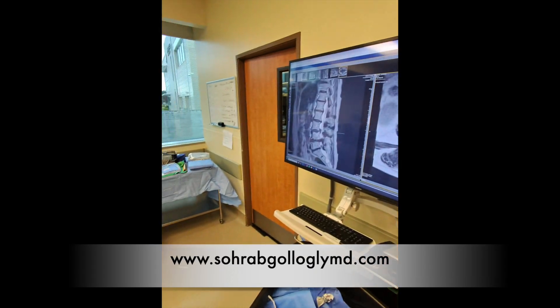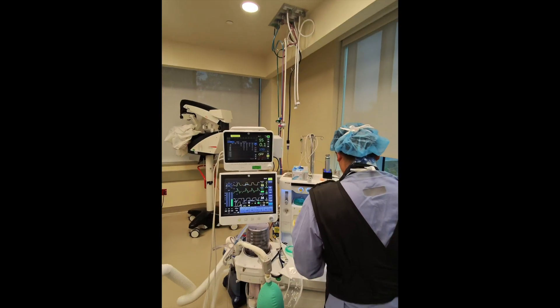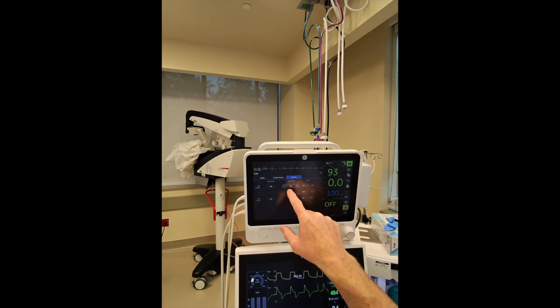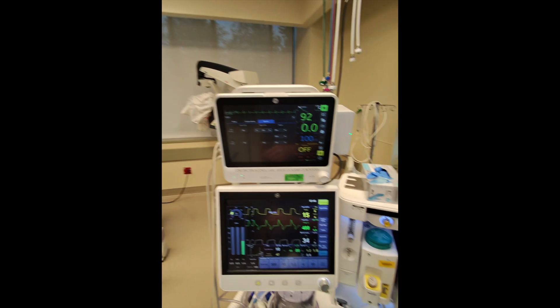Here's my normal setup. The MRI scan is on the monitor. My scrub tech has the equipment they're opening now. I come over to anesthesia and set the alarm for blood pressure — a high limit of 110 millimeters of mercury — so the alarm starts going off as soon as the pressure starts trending up.